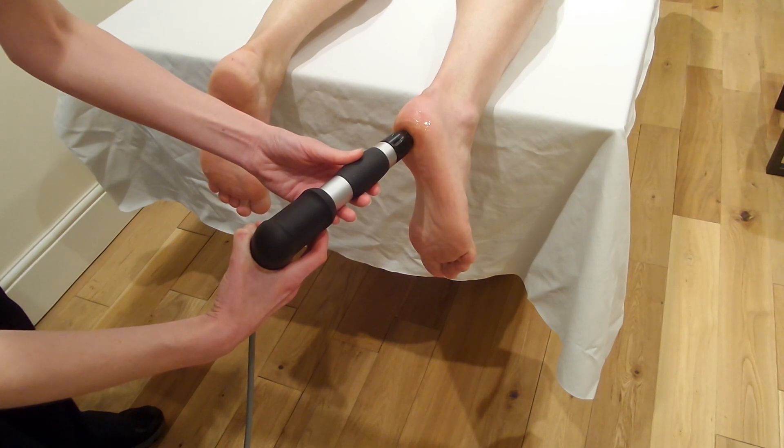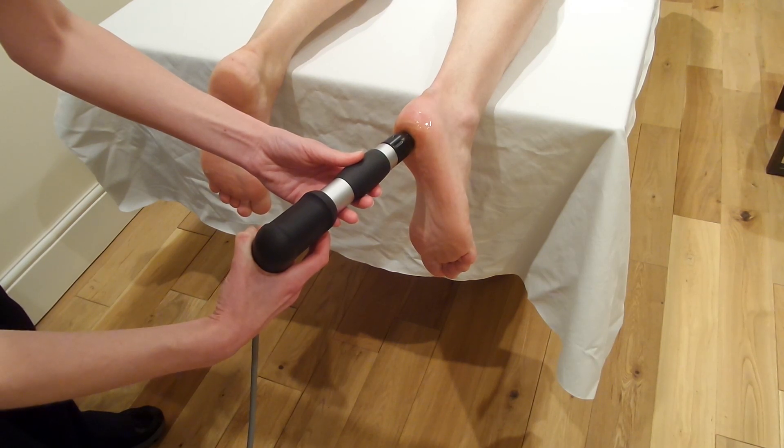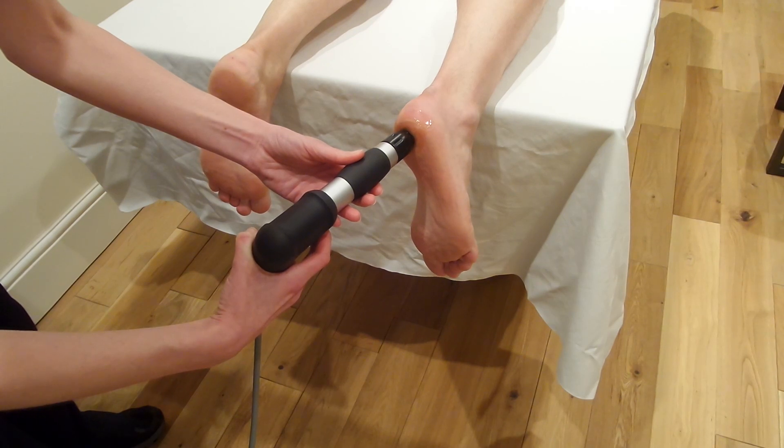This would be exactly the same treatment you would do for a bony heel spur — an inferior bony heel spur. The only difference may be that with a bony heel spur you might go slightly higher on the power. Keep applying the shocks to the same area until all 2,000 shocks have been applied.